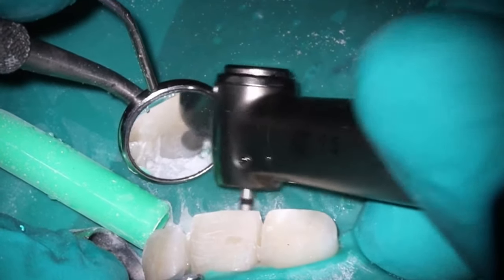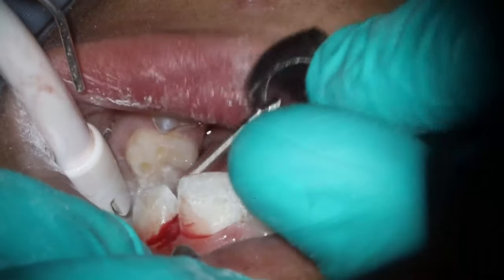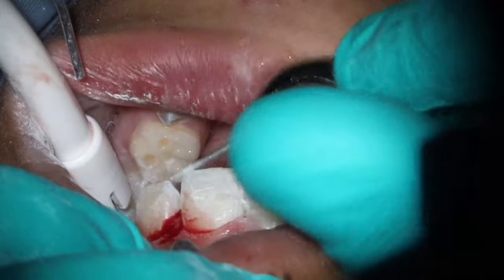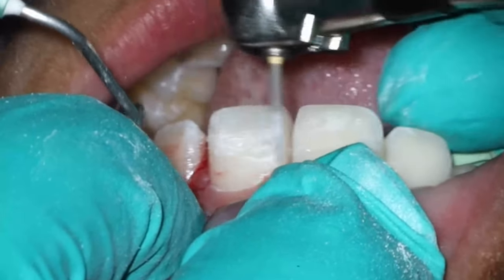You know, his problem is he has a pretty much 100% overbite, and you'll see why that becomes an issue here. Next thing I like to do is with the rubber dam off, work on those gingival embrasures. The reason I like doing it with it off is because I want to see where his eyes are and check the midline with his eyes as well.